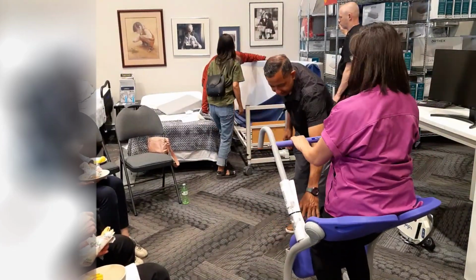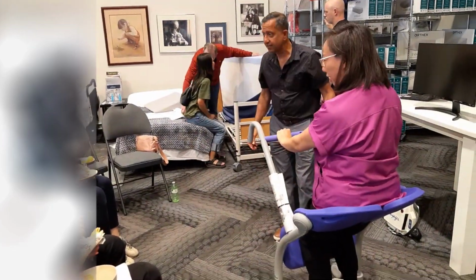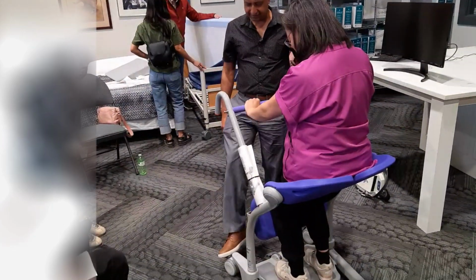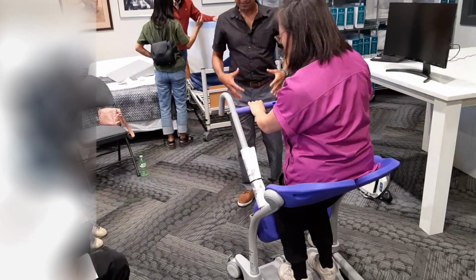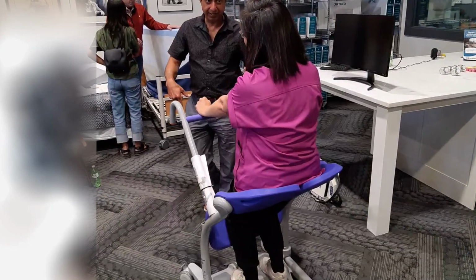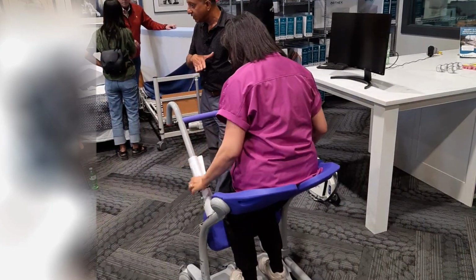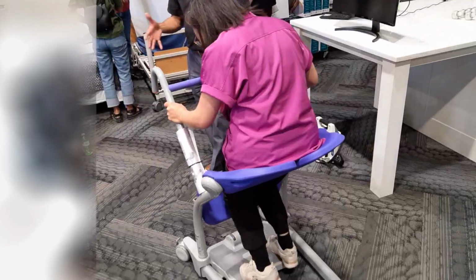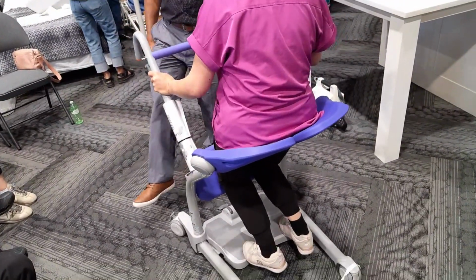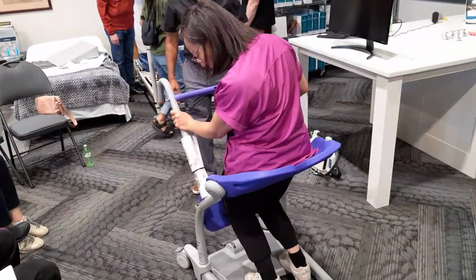Your shin area is all supported by the shin pad. I'm comfortable. I'm trying to shake this. Yeah, if I have the brakes on, now go ahead, shake it. Generally, in the house or in that particular area, you might not have carpet. If you have a regular floor, then it's very easy to maneuver compared to carpet. If they slide their knee, they're not going anywhere.